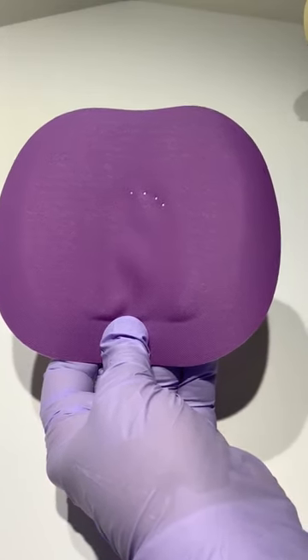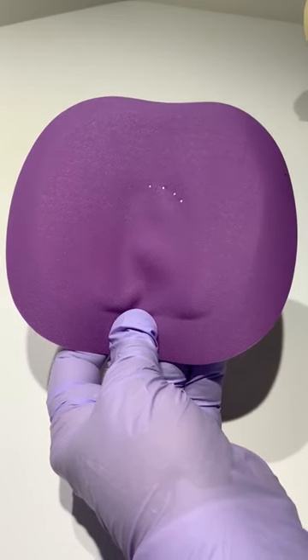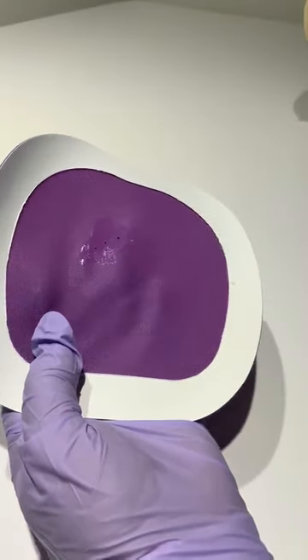When using Wedget cord to isolate a mini isolation, punch four holes into the dental dam. I'm using the Flexa dam frame. Place water-soluble lubricant on the tissue side of the dam.